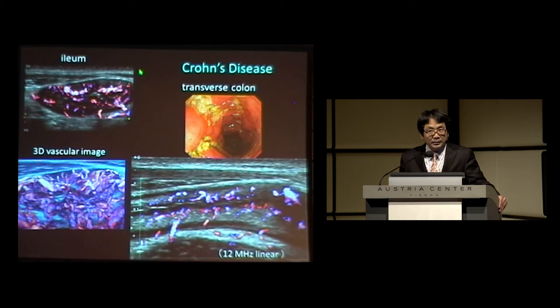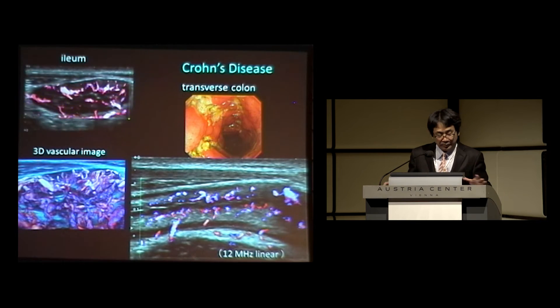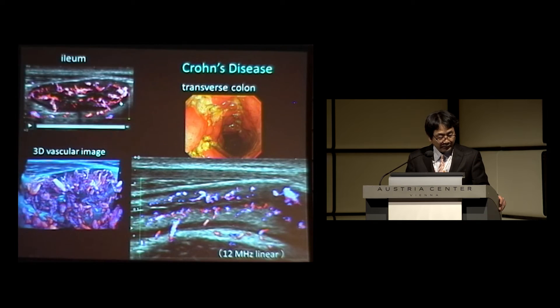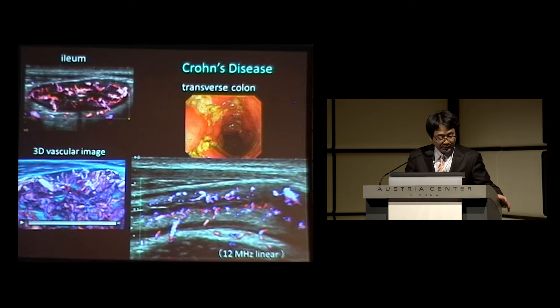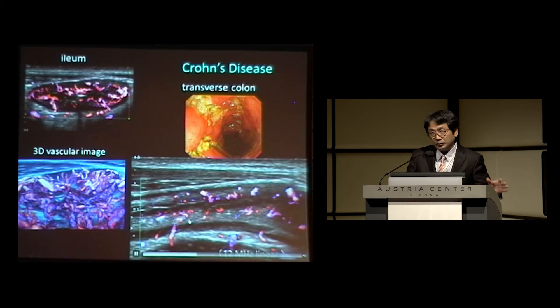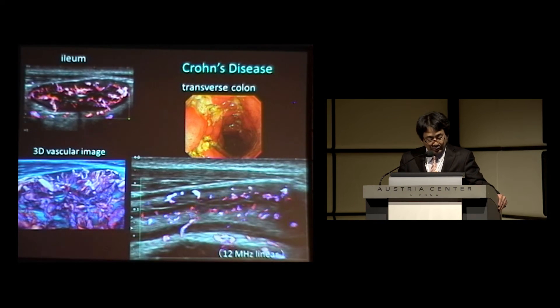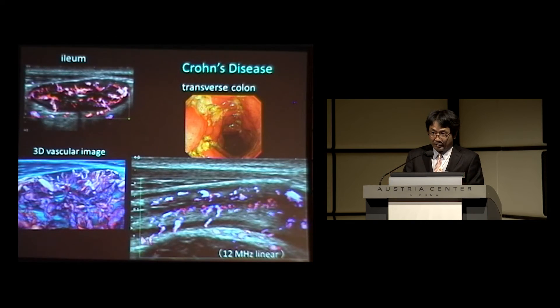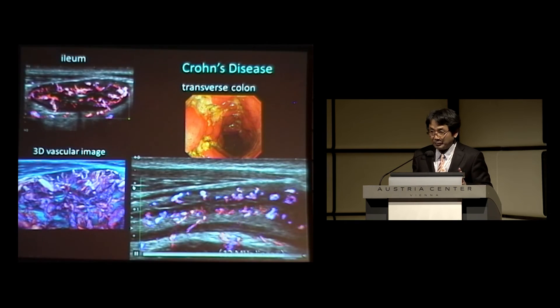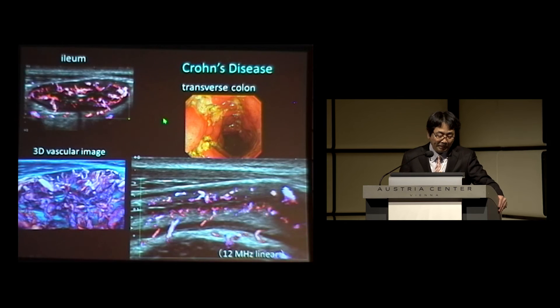The same can be applied to Crohn's disease. This is a transverse view of the ileum, and you can see hyperemia in the ileal wall — transmural hyperemia. This 3D vascular image is more visually appealing, showing the blood vessel structures inside the ileal wall. In this longitudinal view of the transverse colon, you can detect hyperemia throughout the entire bowel segment, indicating severe inflammation, which was also confirmed by endoscopy.